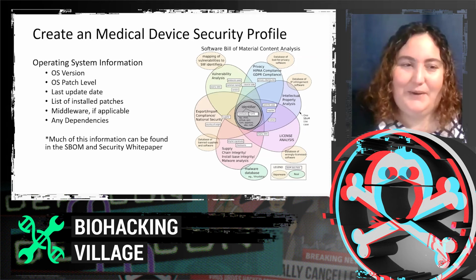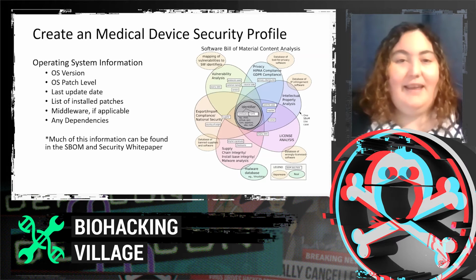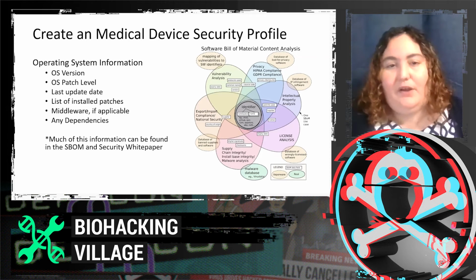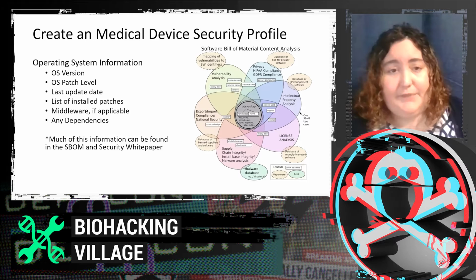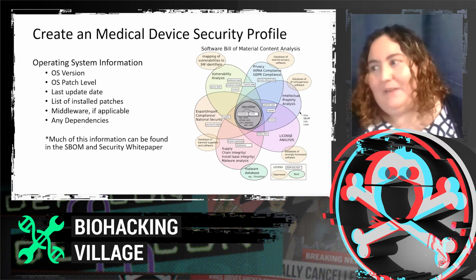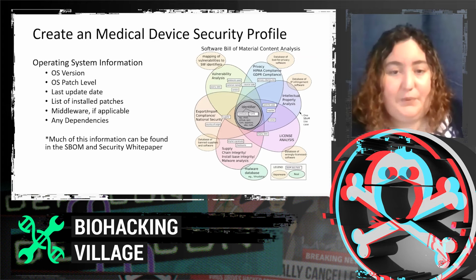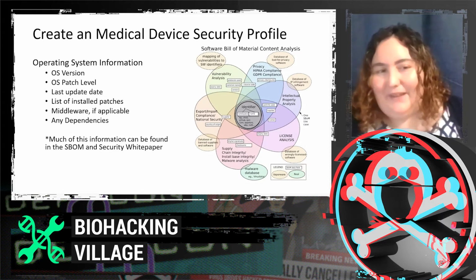You're going to want to create this, as part of creating this medical device security profile: the software bill of materials and your security white paper. Many manufacturers are now in the process of collecting this information. As you can tell, the software bill of materials is important for a variety of reasons. It's involved in vulnerability analysis, in your privacy concerns, in pretty much everything.